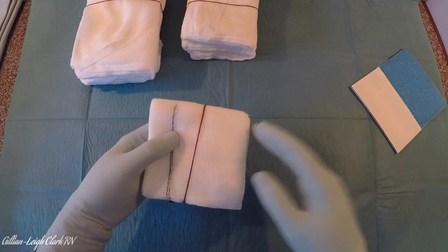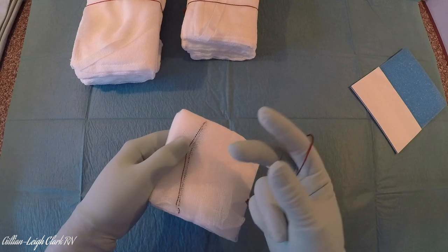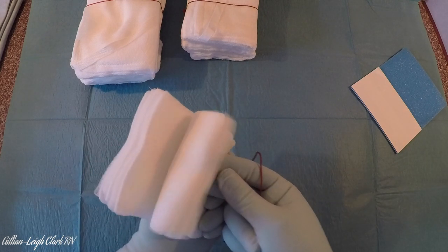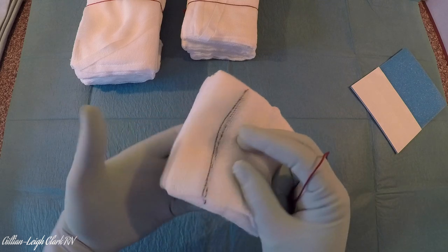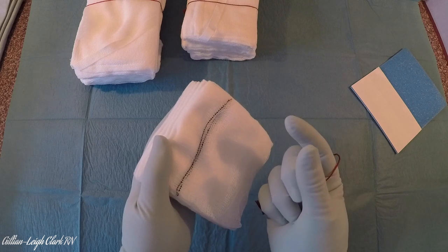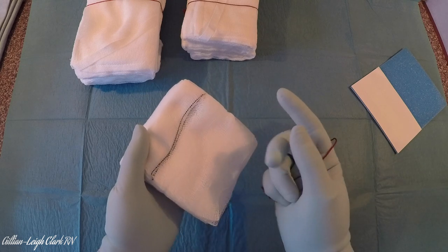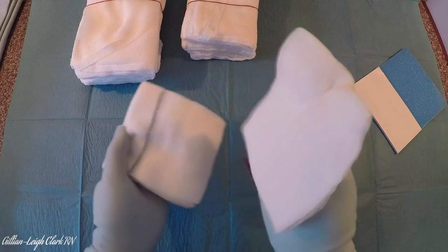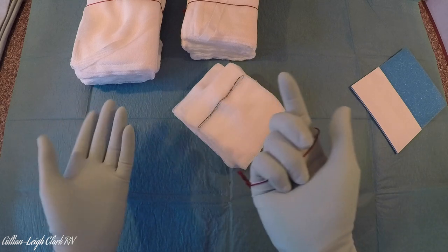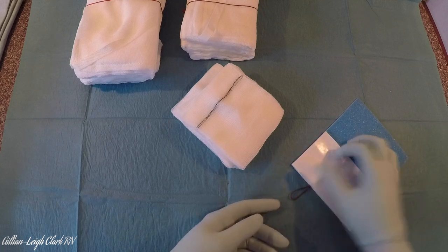With my floor person, I say 'check 5, red tag.' When counting these swabs, they have a closed side and an open side just from the way they're folded. I find it easier to hold them in one hand and pinch closer to the closed side than the open side so they don't open up and separate. We're checking that it is one swab, that it has a Raytex strip, and that it's intact. So we go: check 5 — pinch 1, 2, 3, 4, and 5. The red tag would then go away in line with your local policy and be documented accordingly.